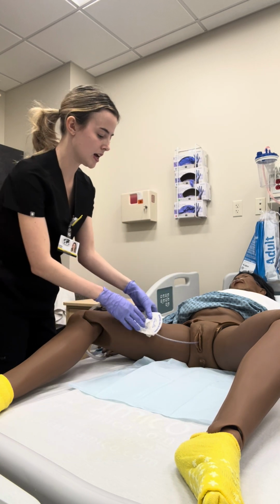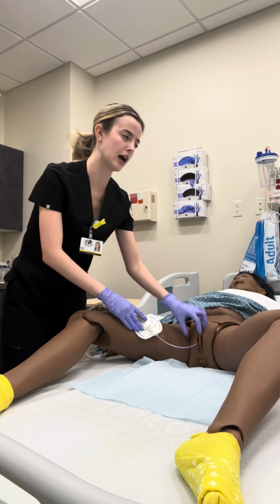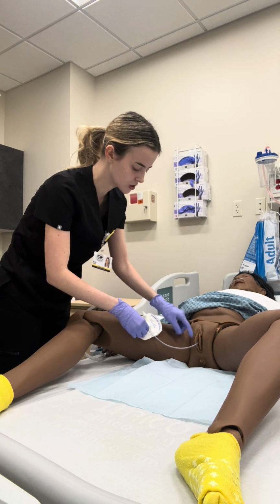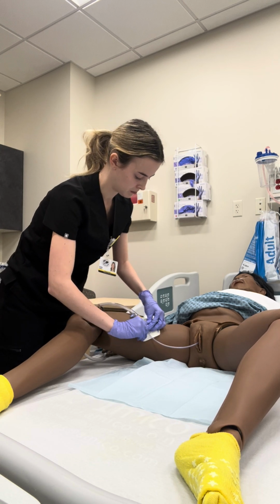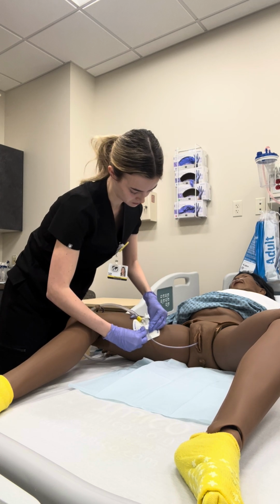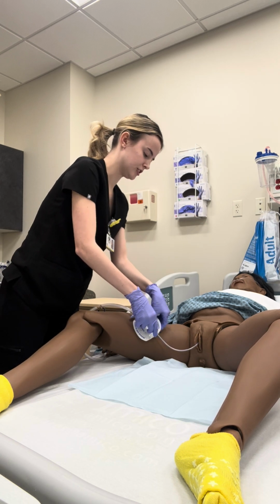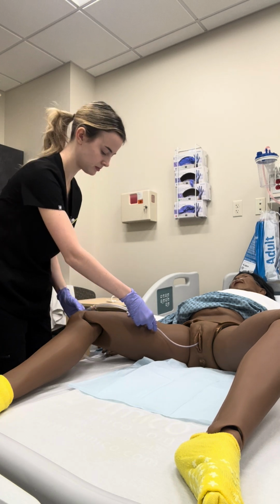Right, and once that's done, I would want to remove the stat lock first, and while I'm doing that, I want to stabilize the catheter and make sure that when I'm removing this, it's not tugging on the catheter. So I would stabilize that, use alcohol to remove this. Then I just remove the stat lock, would throw that away.